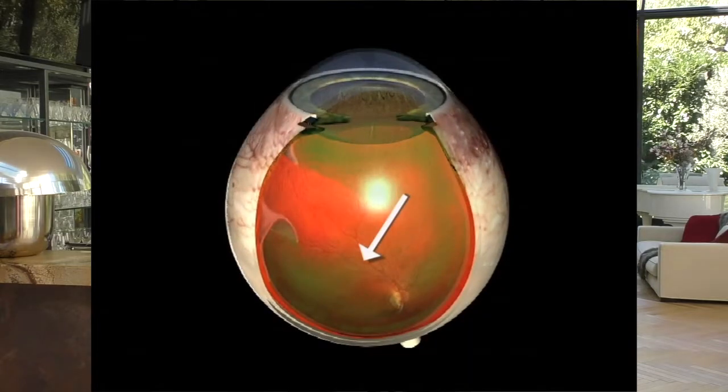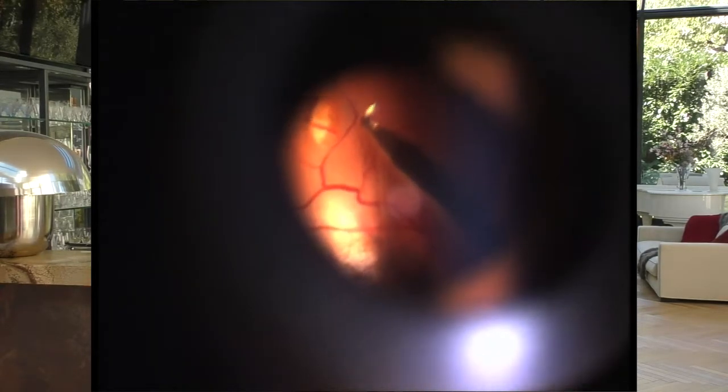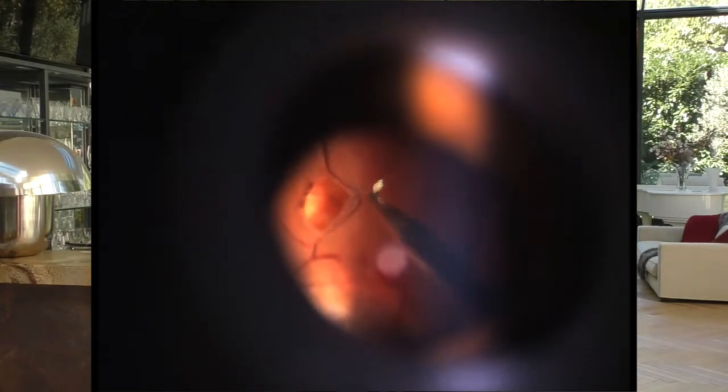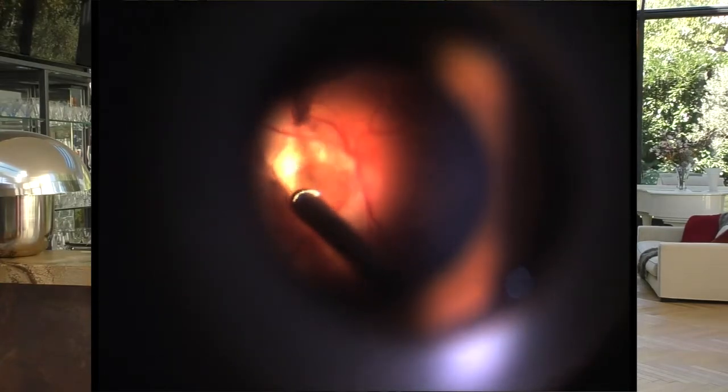The same is true in cases of giant tears or posterior tears. Several therapeutic roles are required in those cases: stopping the blood-aqueous barrier breakdown, peeling the posterior hyaloid, repositioning a retinal inversion, or cutting an adhesion on the posterior pole, a whole bunch of things that an indentation cannot do, and despite its inherent complication rate, vitrectomy is mandatory.